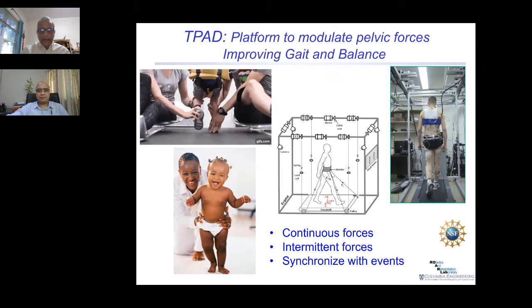And again, this is a very important part of robotics, because often we make robotics which are exoskeletal kinds of devices, which are wrapped onto the arms or the leg. But there we are facilitating the motion, but it's not necessarily a good tool for motor learning. And learning is all about having experiences, you make errors, you fail, and we allow you to retune your movement through those experiences.